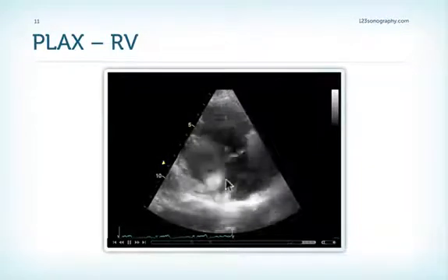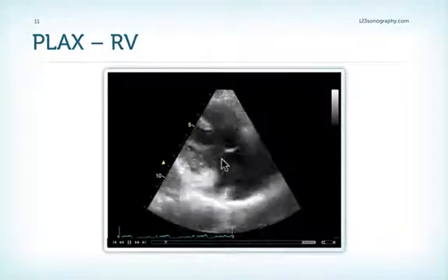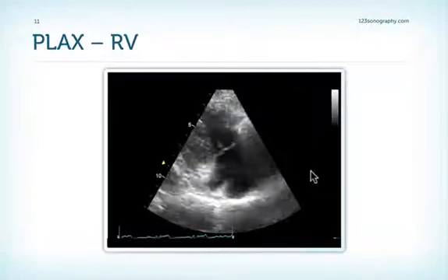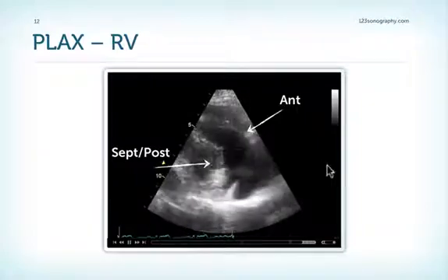However, we also see the coronary sinus, which is usually very close to the posterior leaflet, so theoretically it could also be the posterior leaflet. So we have the anterior leaflet here and either the septal or posterior leaflet here.